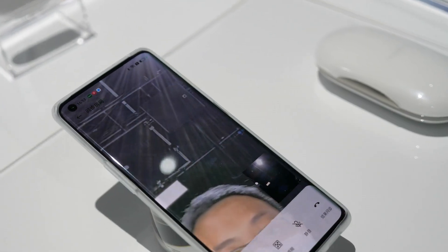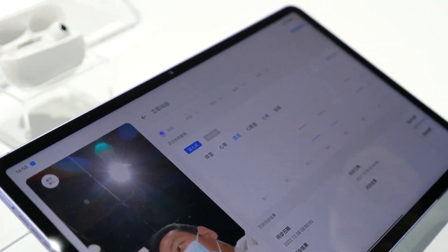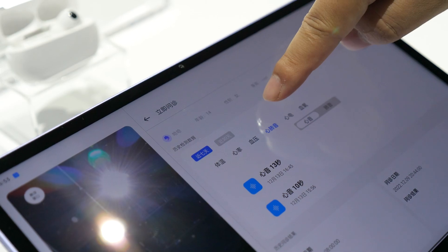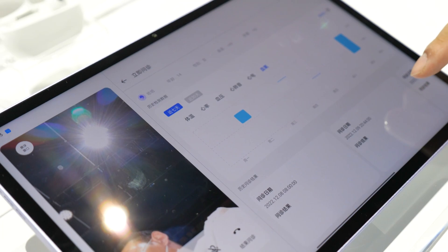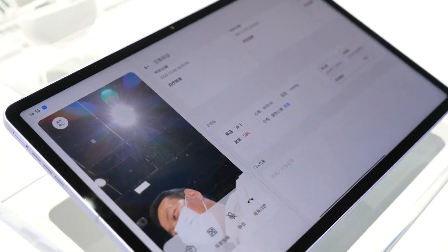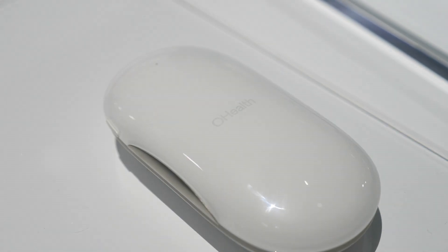You can send this report directly to your doctor. So you can generate temperature, heartbeat, blood pressure, sound, and ECG — the doctor can view this resource directly. You don't even need to go to the hospital. Cool — the OHealth H1.